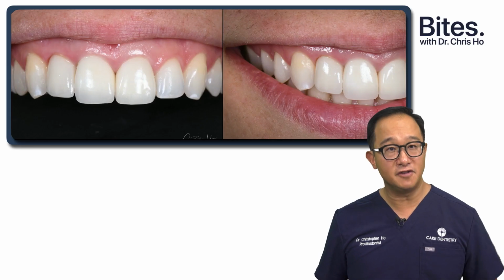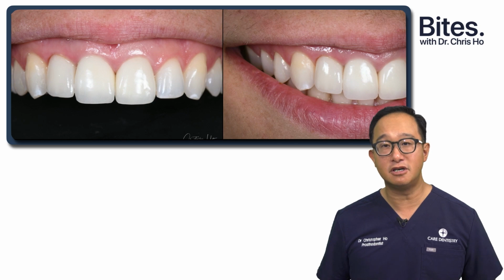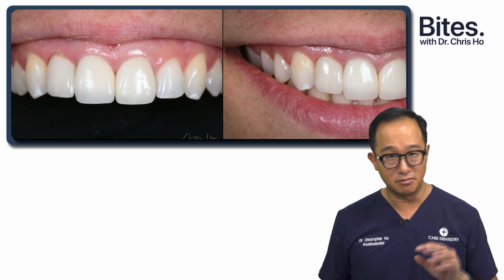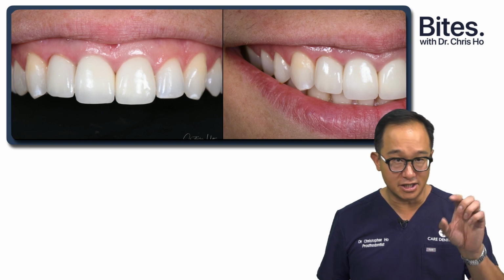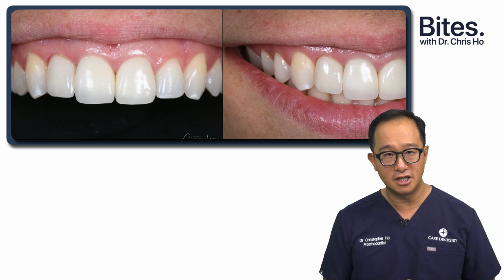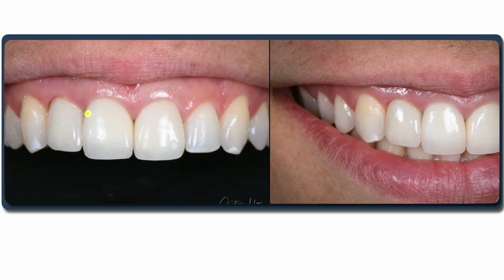So you can see the day of issue, we've seen an improvement of the aesthetics, the soft tissue aesthetics around the patient. There's some minor gingival irritation from me taking it on and off, but you can see already there's been some improvement. You see that now the mid-labial gingival margin around the lateral incisor has dropped down. Before it was more apical. And also you've seen the closure of the black hole that was present between the central and the lateral incisor.